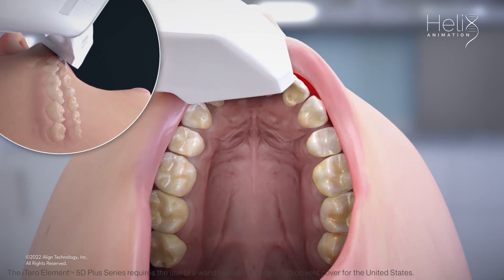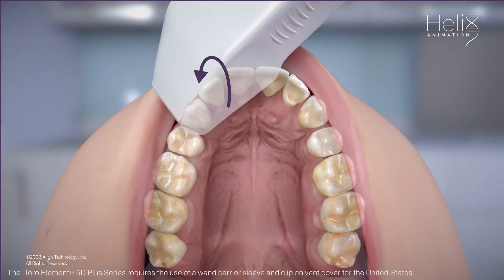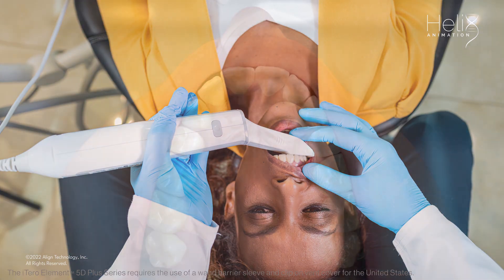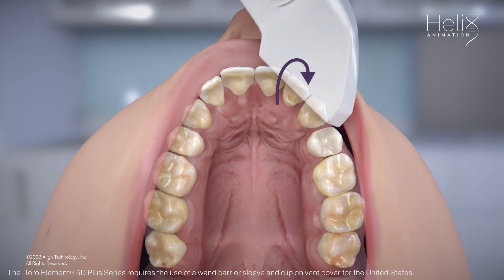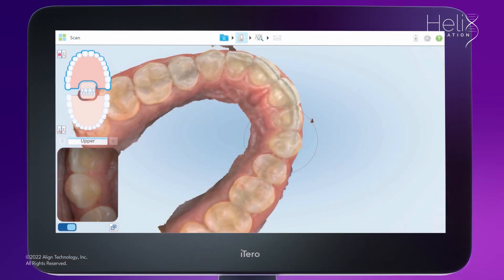Next, capture solid anterior incisal anatomy by placing the wand so that the cuspid and lateral are centered in the viewfinder, and then roll from the lingual surface over the incisal edge to the facial. Repeat this step on the contralateral side. These scans help to verify that the lingual segments and buccal segments are joined with accurate incisal surfaces. This step is critical for properly fitting Invisalign aligners.